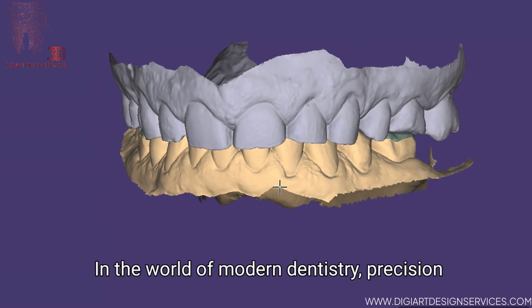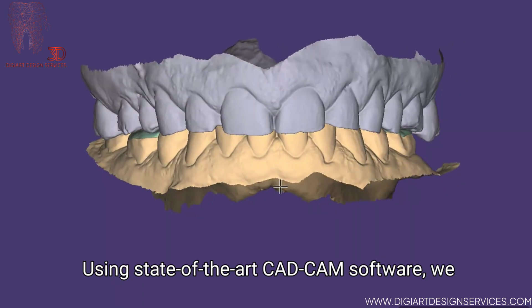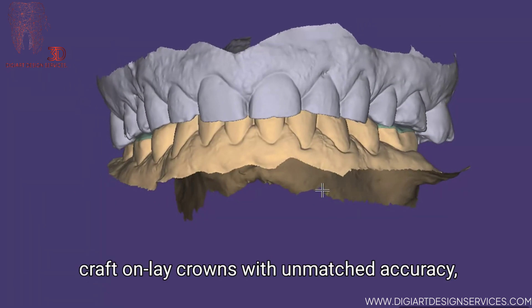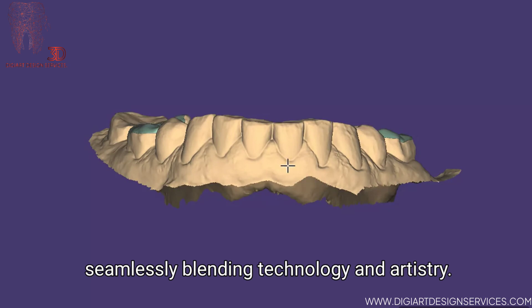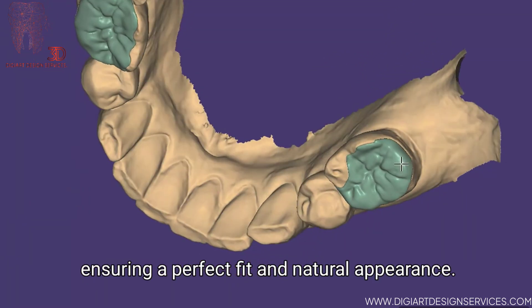In the world of modern dentistry, precision and aesthetics go hand in hand. Using state-of-the-art CAD-CAM software, we craft onlay crowns with unmatched accuracy, seamlessly blending technology and artistry. Every detail is meticulously designed, ensuring a perfect fit and natural appearance.